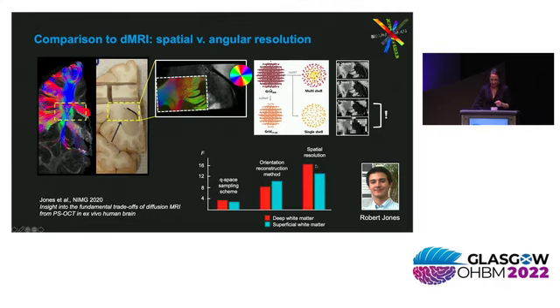We collected diffusion data in a 9.4 Tesla preclinical scanner in a way that allows us to compare different Q-space sampling methods, multi-shell, single-shell Cartesian. And also we downsampled the data from their original 0.25 millimeter resolution to 0.5 and 1 millimeter and 2 millimeters. And we acquired PSOCT data from the most complex area of the sample.